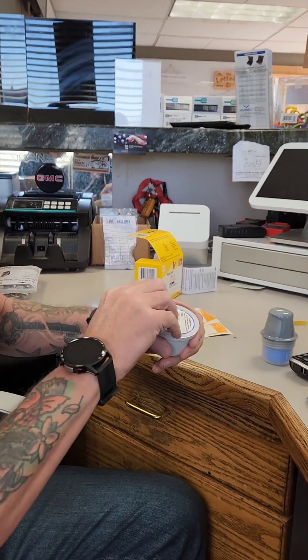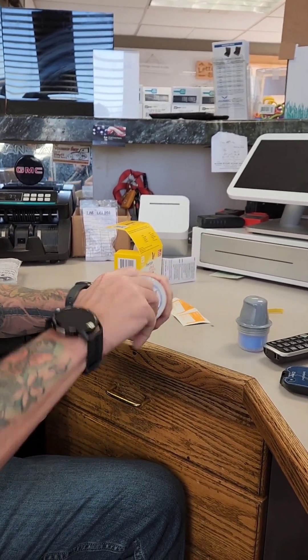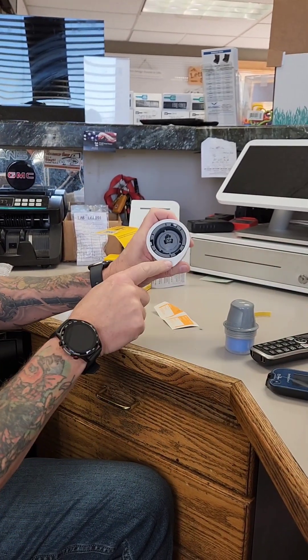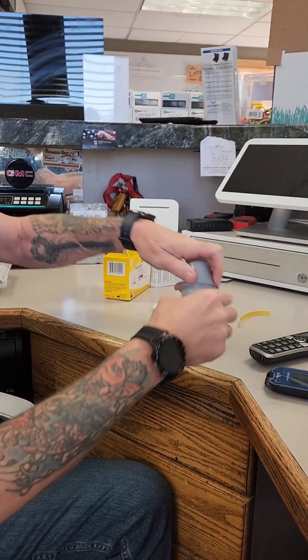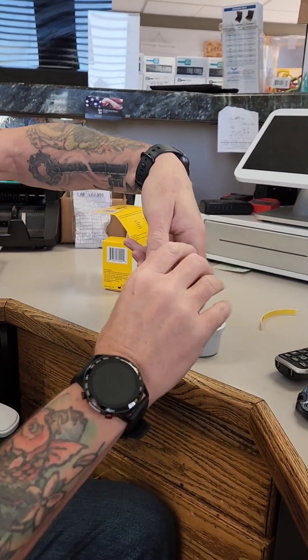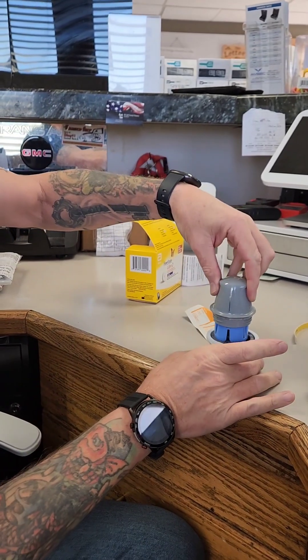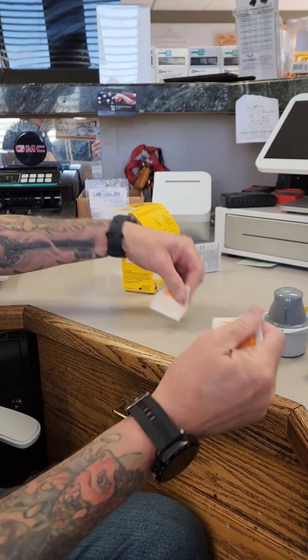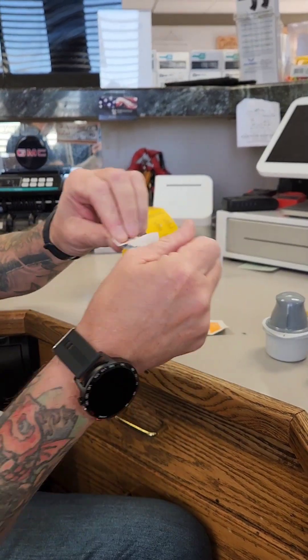What I'm going to do first is open up the little cup that the sensor is in — it has a line on it. Then we'll take the injector, which also has a line on it, and you line those up and stick it in. There are a couple of alcohol swabs here as well.